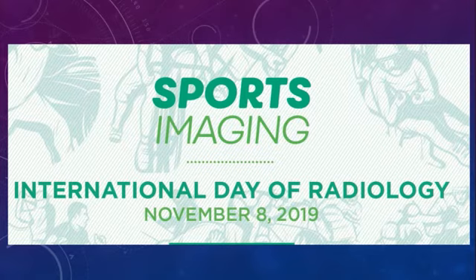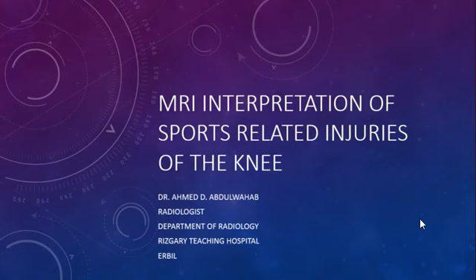So, radiology rocks. And today I have chosen to present a talk about the MRI interpretation of sport related injuries of the knee. I'm Dr. Ahmed D. Abdulwahab. I'm a radiologist working in the Department of Radiology at Rizgary Teaching Hospital in Erbil, and I hope we will have a good time together.